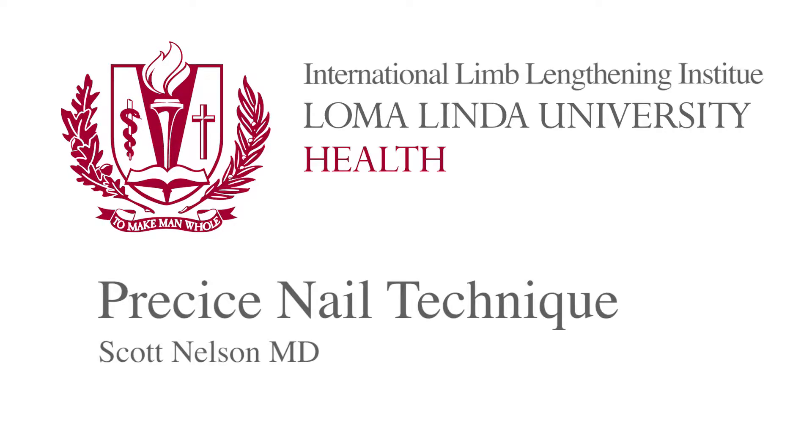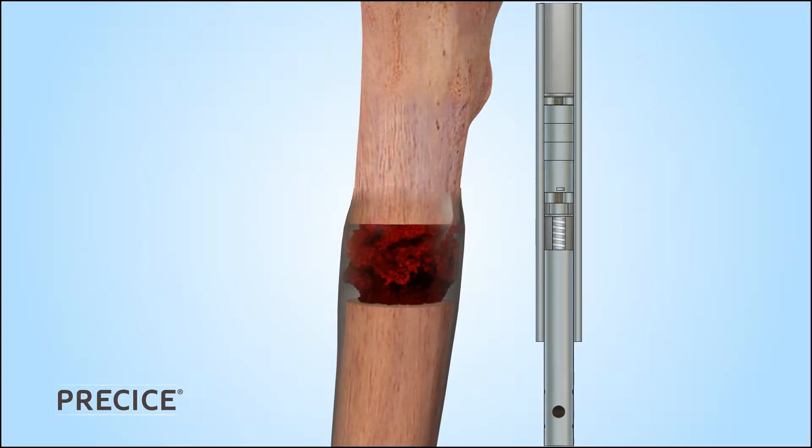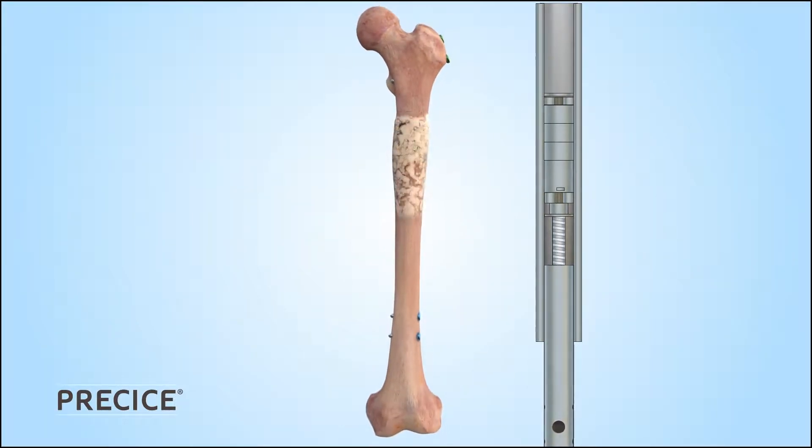This is Dr. Scott Nelson from the International Limb Lengthening Institute at Loma Linda University. I will be demonstrating the surgical technique for placing a trochanteric entry precise magnetic lengthening nail in the femur.